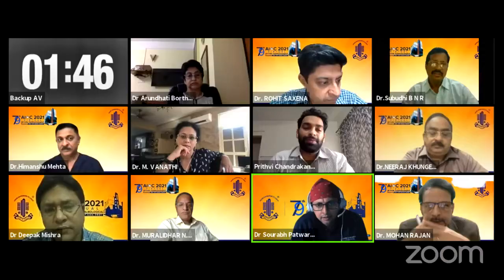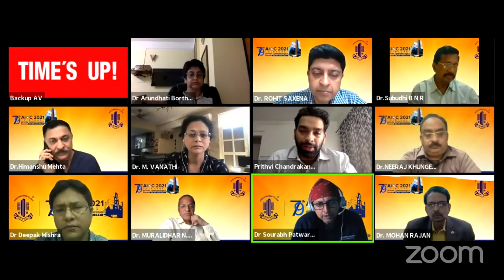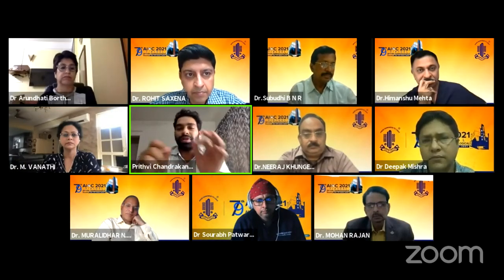Thank you, sir. Just one suggestion: if you can make a stand for this, so that we can use any mobile, put it on a stand where you have this IOL stack underneath, and the distance also you can maintain. Yes, sir. We have actually used a test tube holder, which we use to hold the test tube. We have attached the phone to the holder, and we are moving it up and down wherever we want, according to the site.